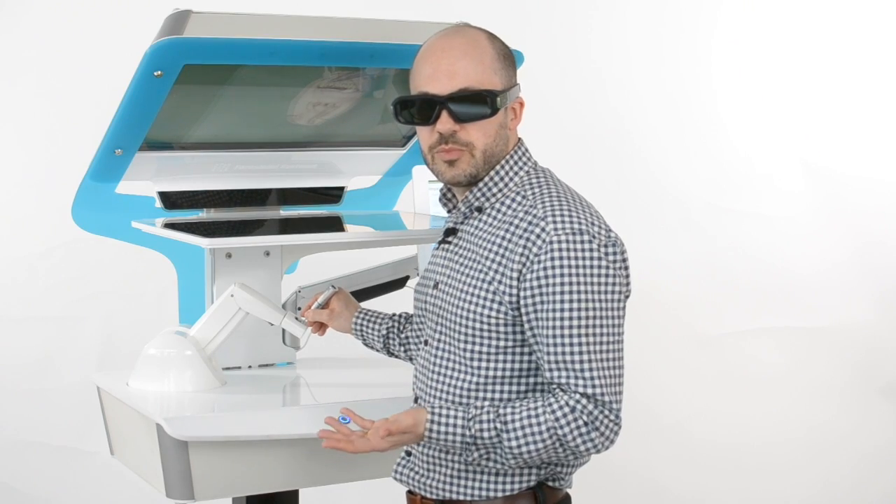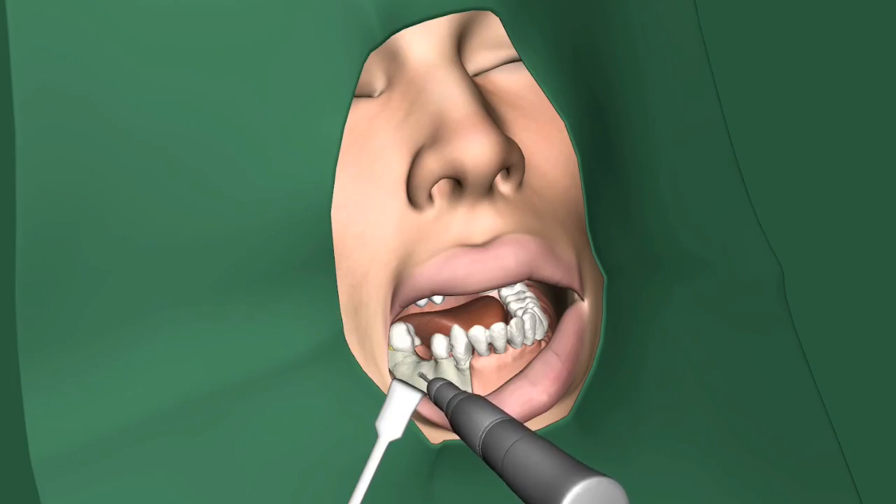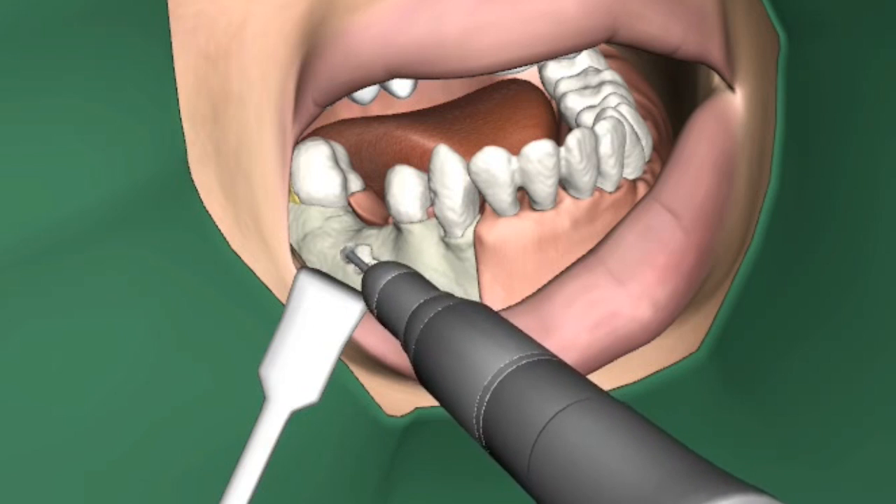To drill, press the left foot pedal. Here we will start by removing some bone to open a window to the tooth we are going to extract.